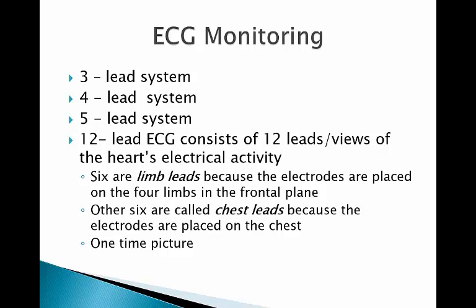So going back to our treatment of someone with angina, all right. Remember we said we can give nitroglycerin for our patient with angina. Well, that's great, but if the patient's truly having an MI and we give them nitroglycerin before we do the EKG or the ECG, then as the vessels dilate and the heart gets more blood and the pain goes away, we're not going to get the same picture as we will for someone who is actively having angina and we do the ECG first, okay? So this is why we must always do the ECG prior to the administration of nitroglycerin, okay?